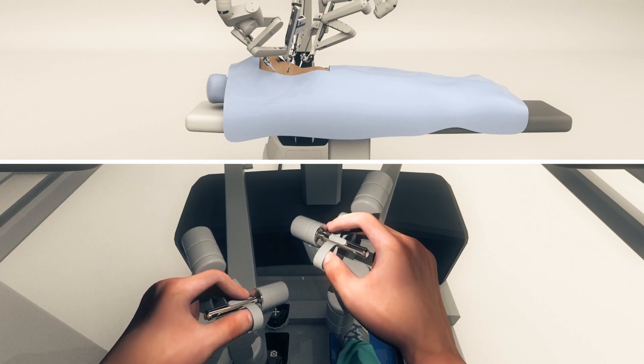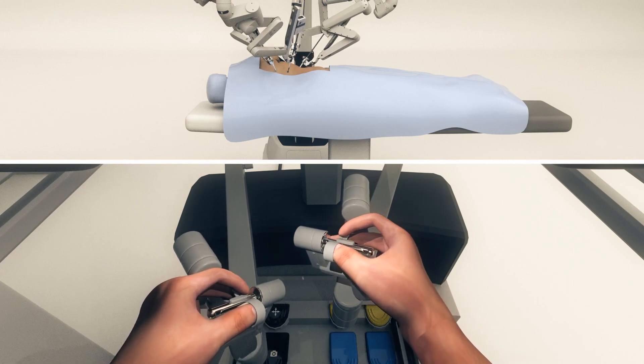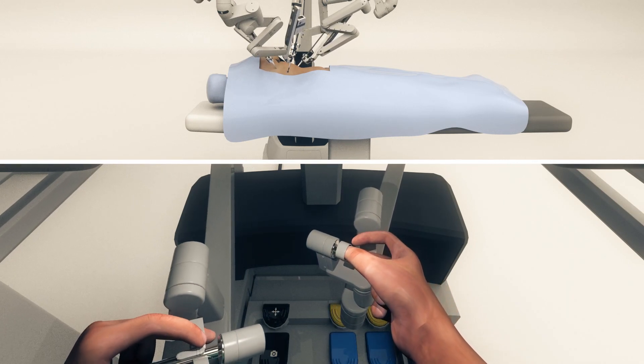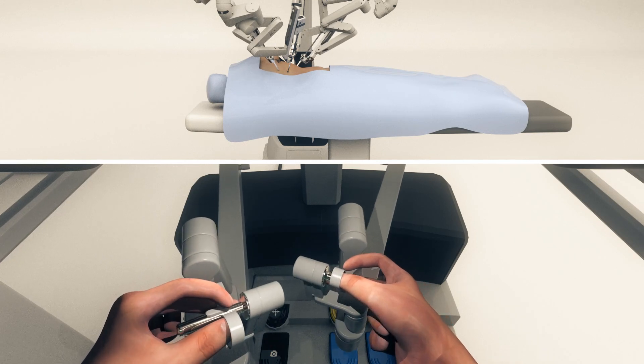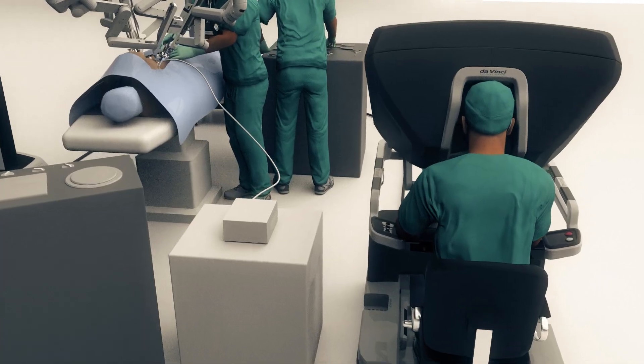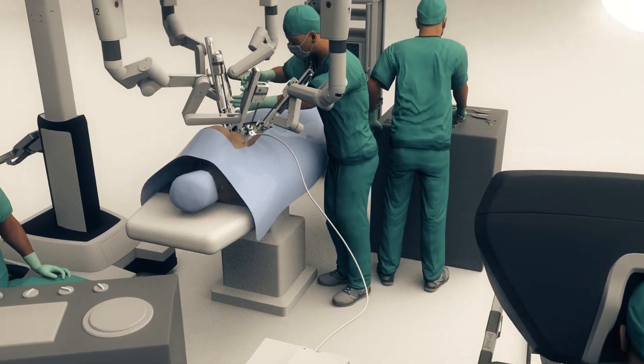With the aid of da Vinci, the surgeon is able to perform complex and delicate surgical maneuvers entirely within the chest cavity rather than through large incisions with rib spreading as is required in traditional surgery.